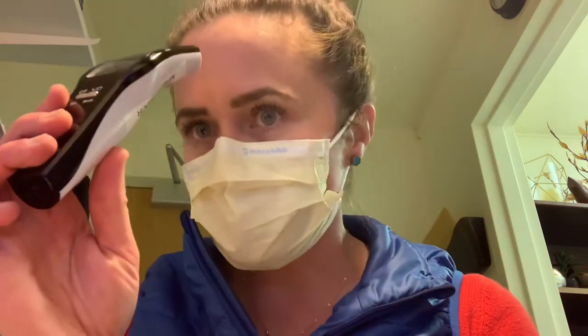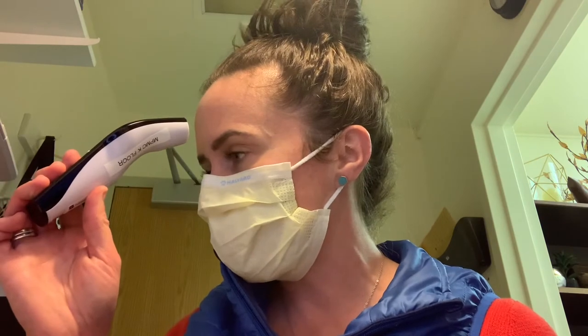Now it's back on person mode — we're going to hold it just an inch or two away from my head. It should be taking the temperature. That says 36.5, which is almost the same as the other one, which was 97.8 — very similar readings.